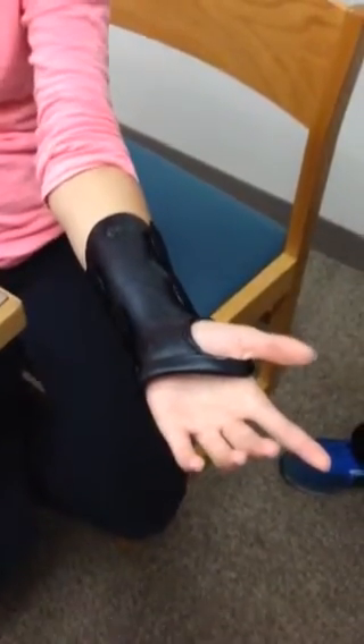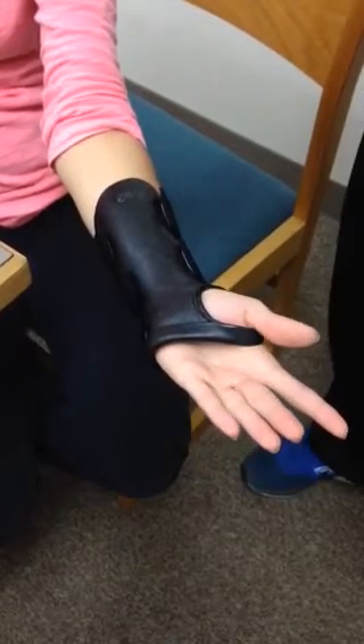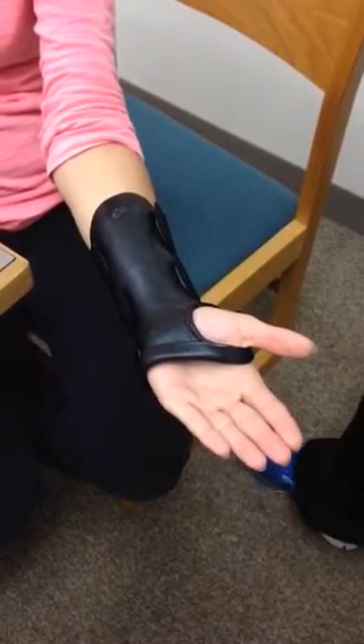This is your wrist cock-up splint. Typically we'll fit a patient in a wrist cock-up splint after coming out of a cast for a distal radius fracture or median nerve injuries.